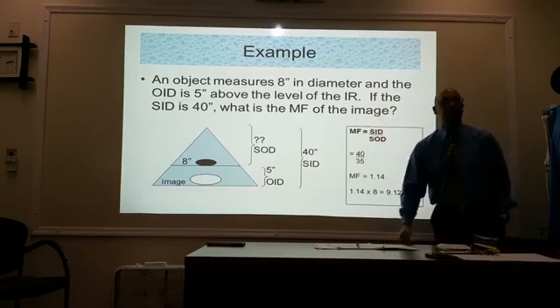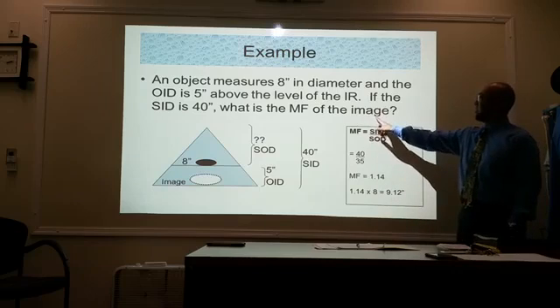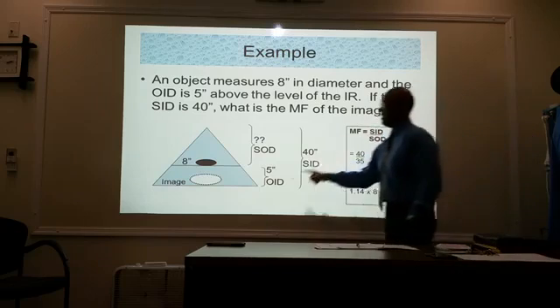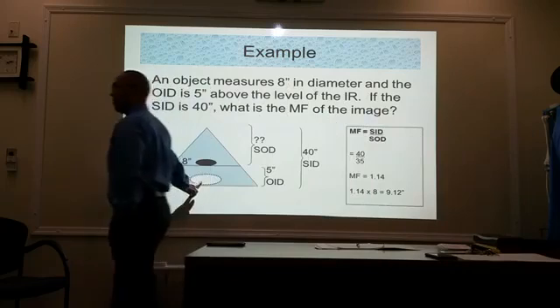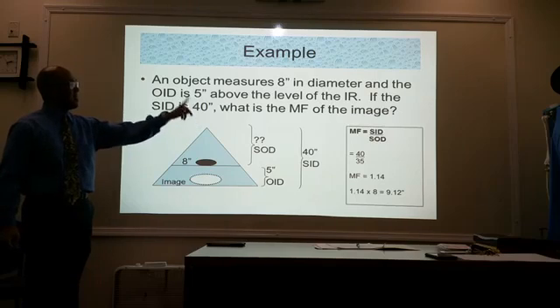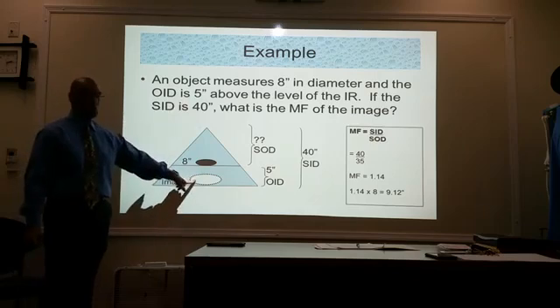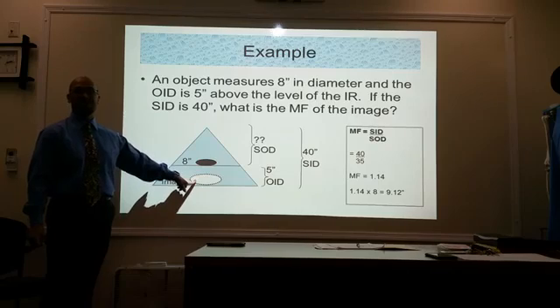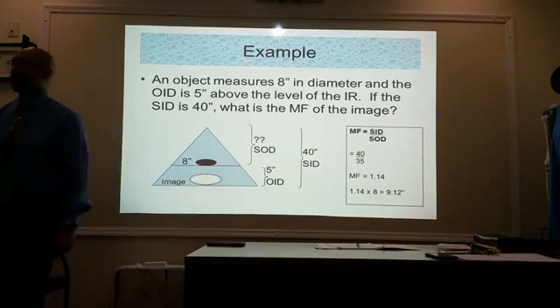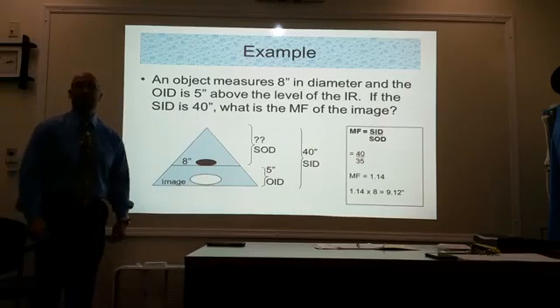What is the magnification factor of the projected image? This is your projected image, the shadow of my hand. Simple formula, SID over SOD.